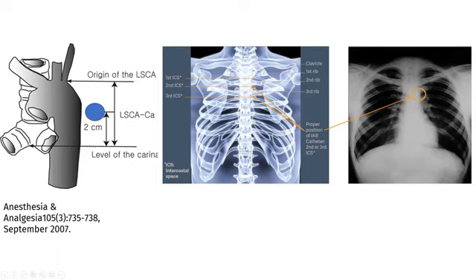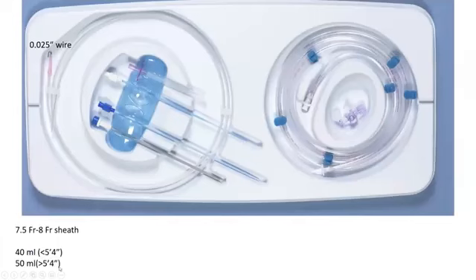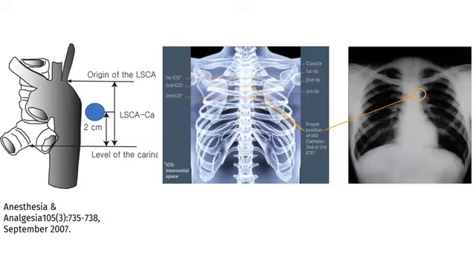But you cannot control that. It depends on the height of the patient. If the patient is around the margin of those, if the patient is 5'4", 5'5", 5'6", that 50 milliliter balloon may end up below the renal arteries, and that's okay. We accept that. We definitely don't want the balloon pump to migrate in an iliac. The more it migrates distally, the less augmentation you will get.